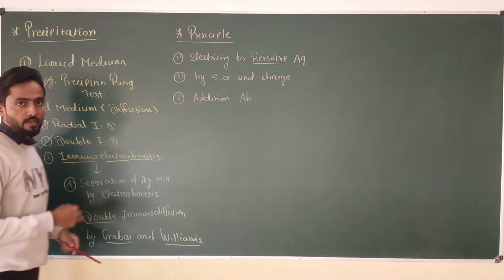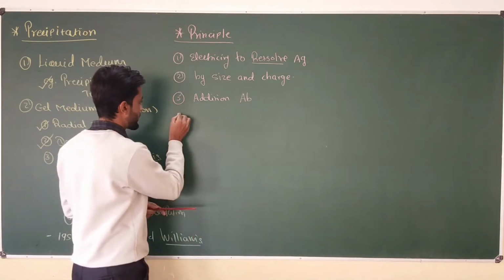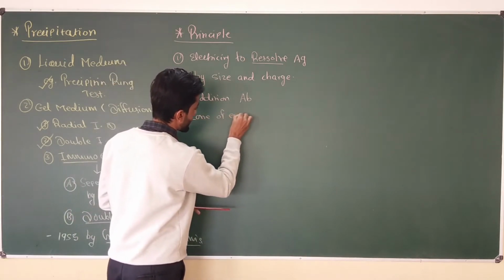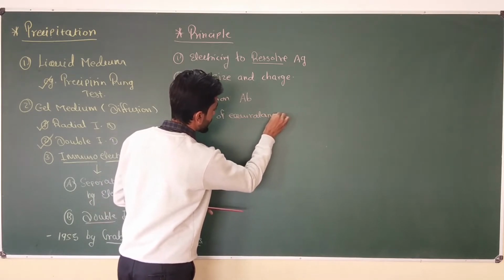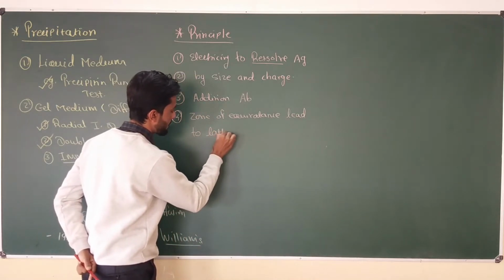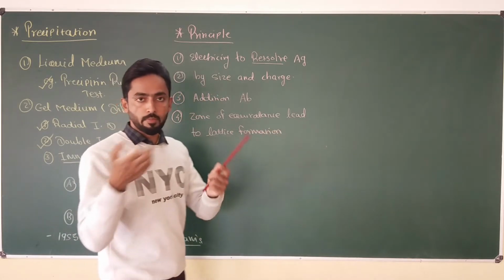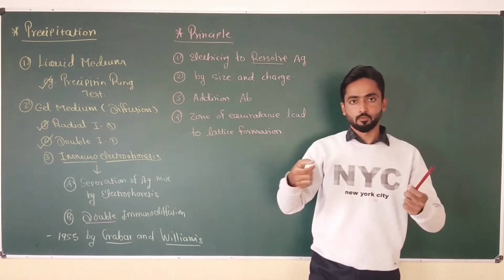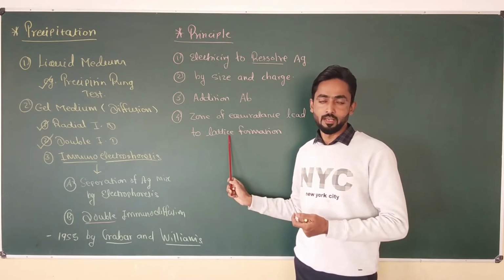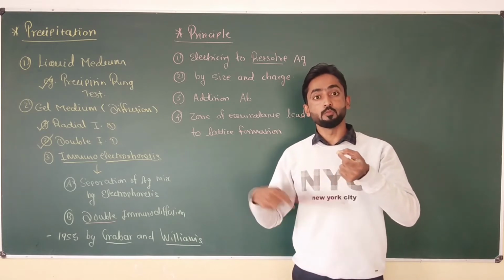Now this antigen and antibody migrate towards one another in the gel, and this is called double immunodiffusion. Due to this migration, a zone of equivalence is reached in the gel, which leads to lattice formation. Antigen and antibody molecules combine with one another, a network is produced which precipitates out in the gel, and this type of antigen-antibody network is called a lattice.